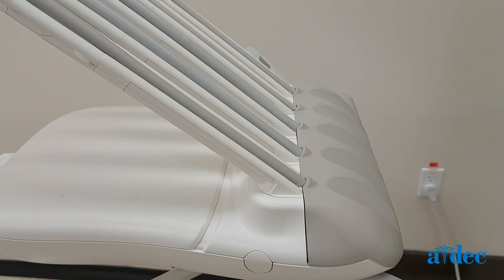The holder pad should now be properly installed with an even gap along the top where the pad meets the whips.